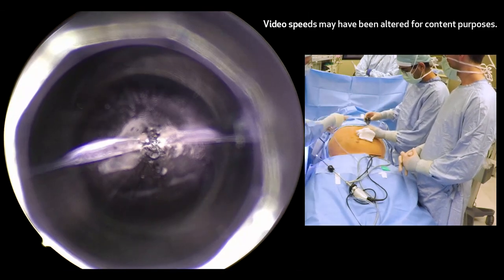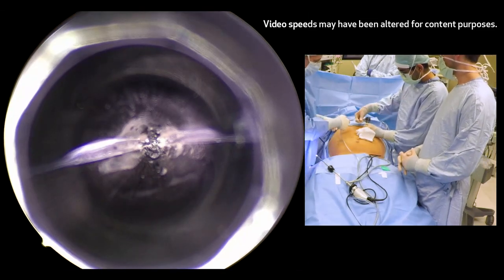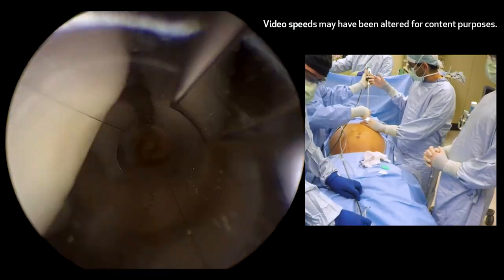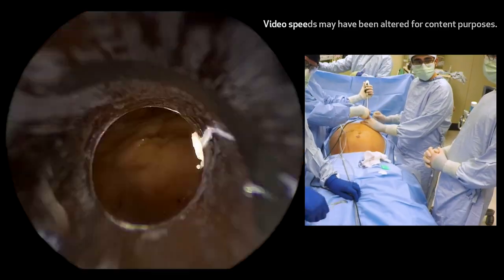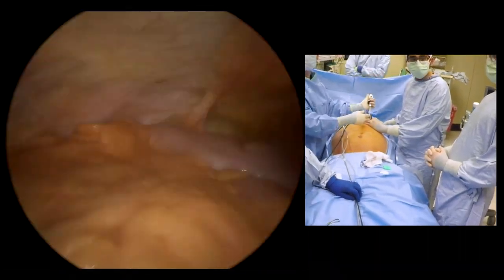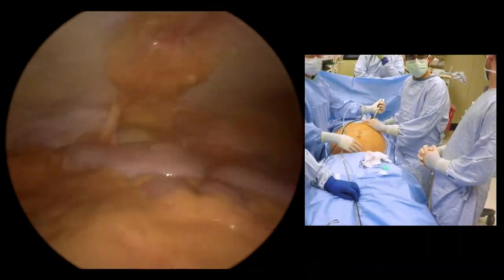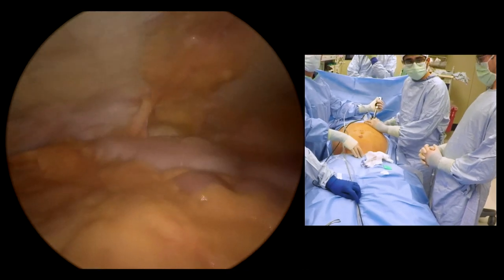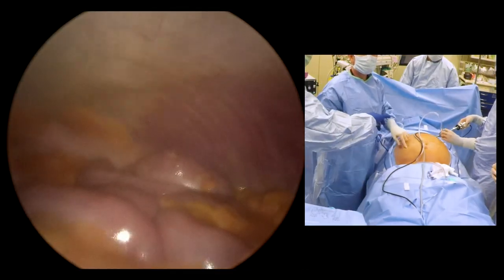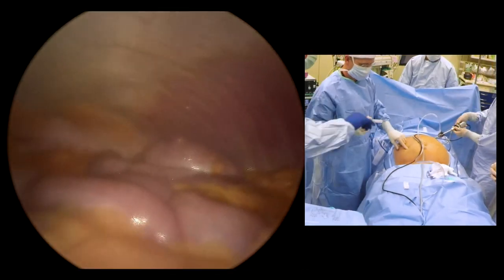Next, we insert a 5 mm port and insufflate the abdomen. Using a 0 degrees scope, a diagnostic laparoscopy is performed in order to identify the need for lysis of adhesions.